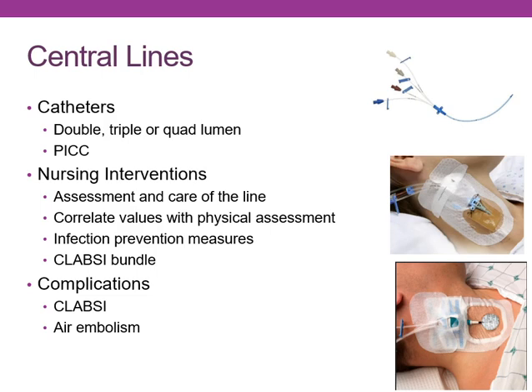There are protocols for the hospital of how often we change the dressing. There might be dressing change teams, but if it's the middle of the night or the weekend, certainly in the unit, we're doing our own. So we need to do that aseptically. We have central line change kits, so get those out. Certainly, do our infection prevention, so wear gloves while we do this, and look at your CLABSI bundle, and the specifics of your CLABSI bundle are in your outline.